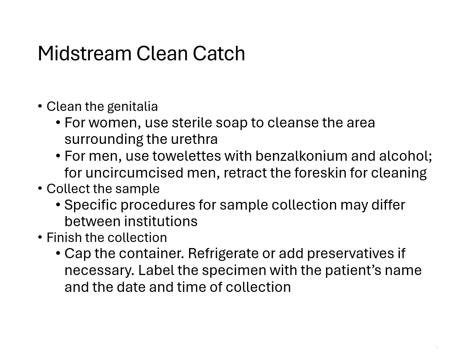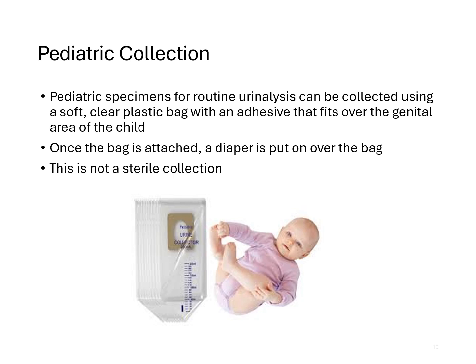And then we are going to refrigerate or add preservatives if needed. For pediatric collection, as you can imagine, they are not potty trained most of the time yet, so it's kind of hard to get urine from them.